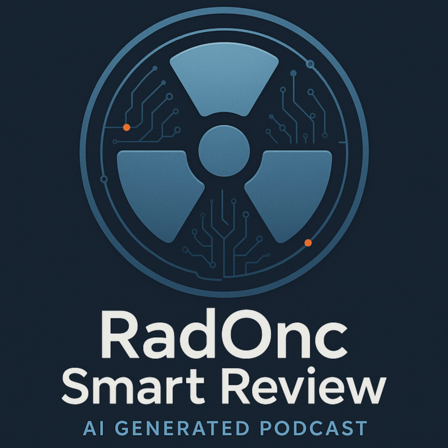Okay, got it. So we have the plan, optimized, sequenced. Now, how does the machine actually deliver this modulated intensity? You mentioned different flavors of IMRT. Right. There are two main ways IMRT is delivered using those MLCs. The first one is often called step and shoot. Step and shoot. Static MLC IMRT. That's the one. So the LINAC gantry moves to a specific planned angle and stops. Then, while the beam is off, the MLC leaves move to form the first complex aperture shape from the sequence.